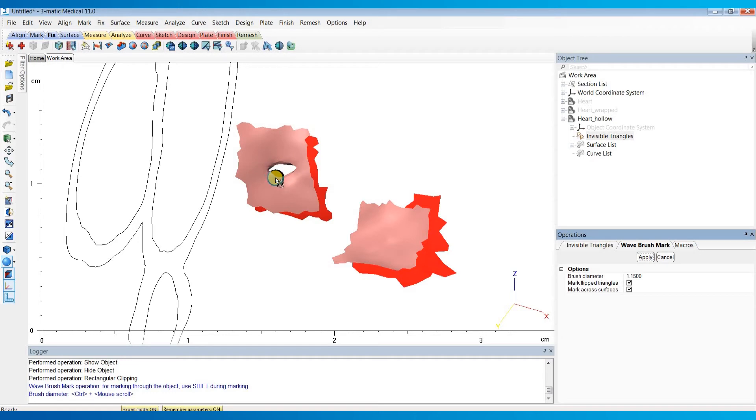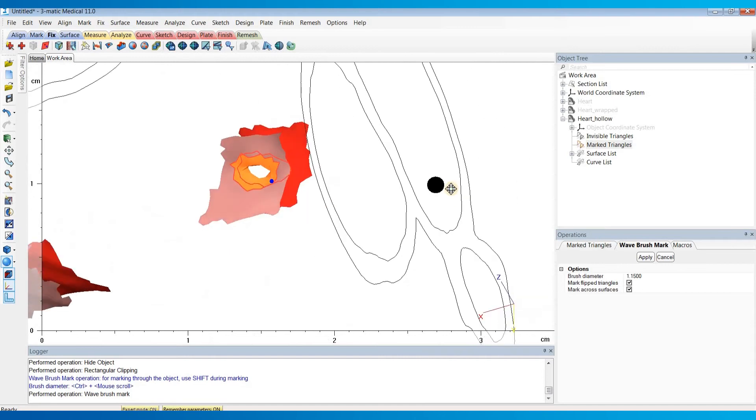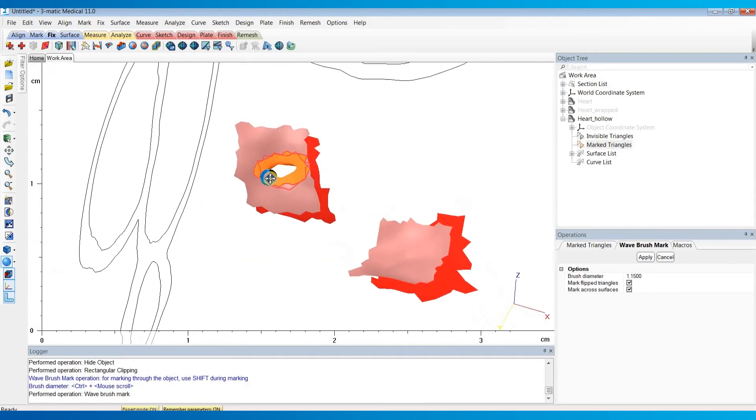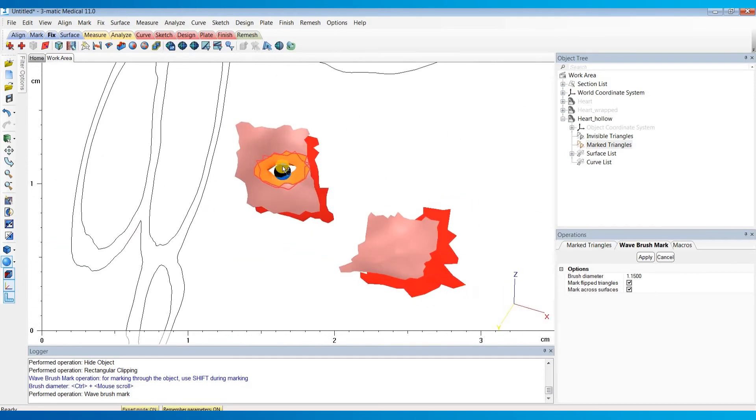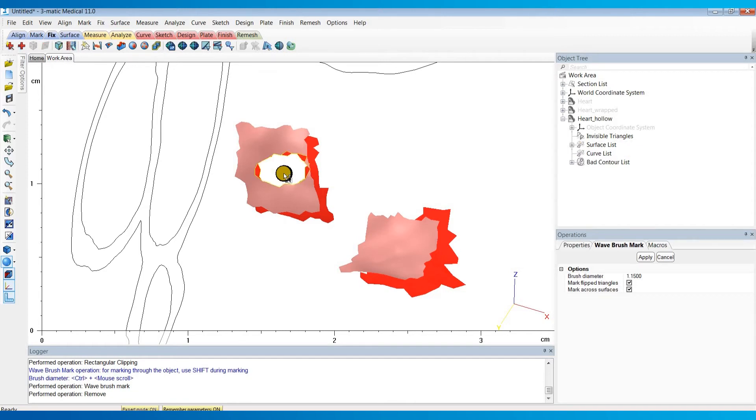When I do so, I'm going to hold down the shift key so that it marks all the way through the screen, and it'll mark both sides of this hole. The marked triangles will appear in orange. You want to go maybe a couple triangles from the edges of these holes. Once you've marked that area, you can hit delete on your keyboard to delete those triangles.